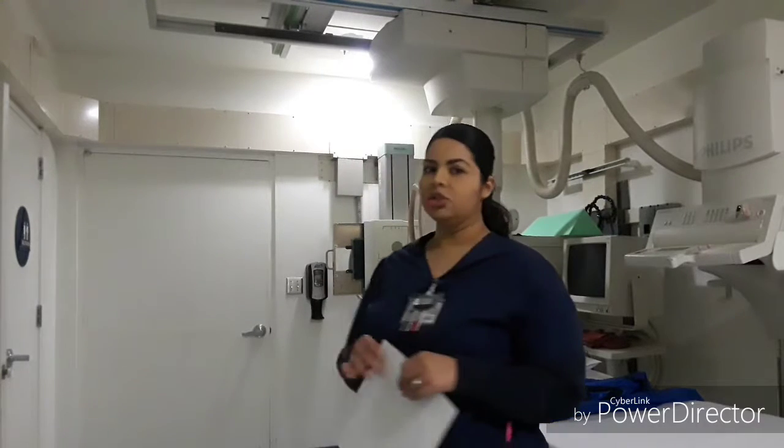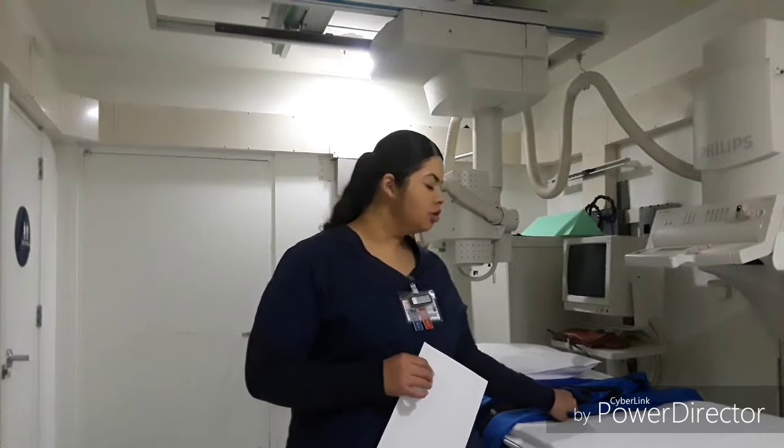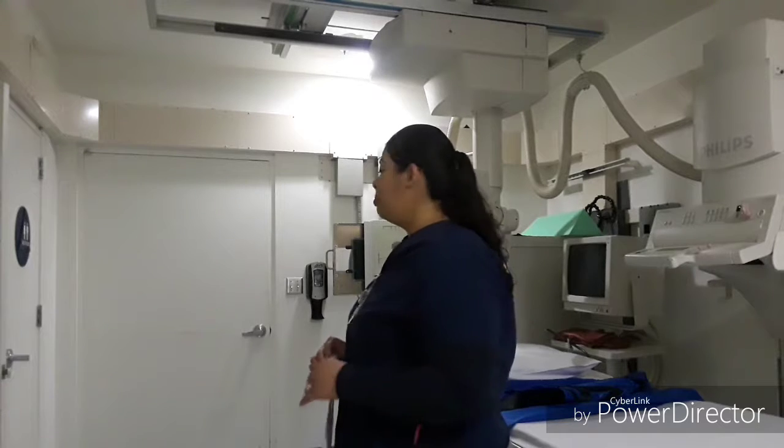I already have my console ready for the wall Bucky. My tube is already detented at 40 inches to the wall Bucky as well. My shield is ready, and I also have my 10 by 12 IR in the Bucky. I've already cleaned the grid since the patient will be fairly close to the grid, and now I'm ready to go get my patient.